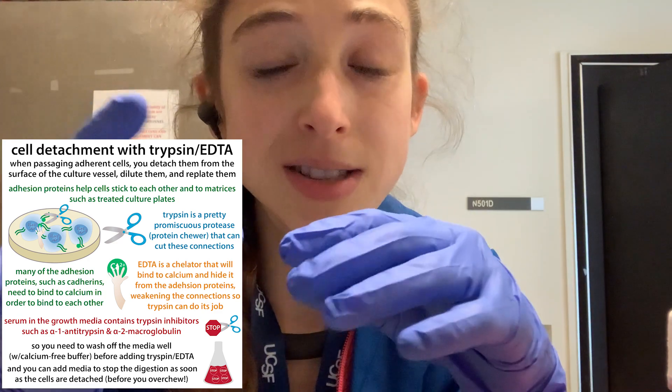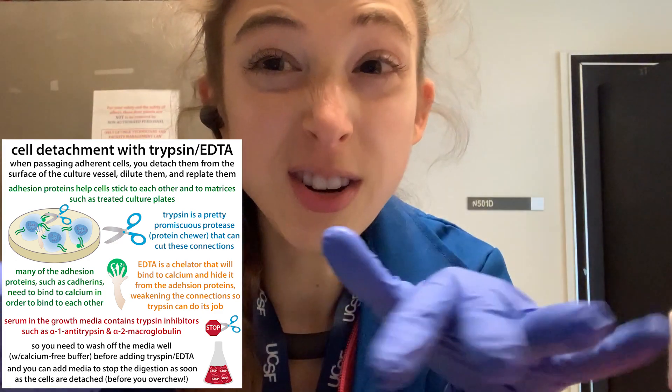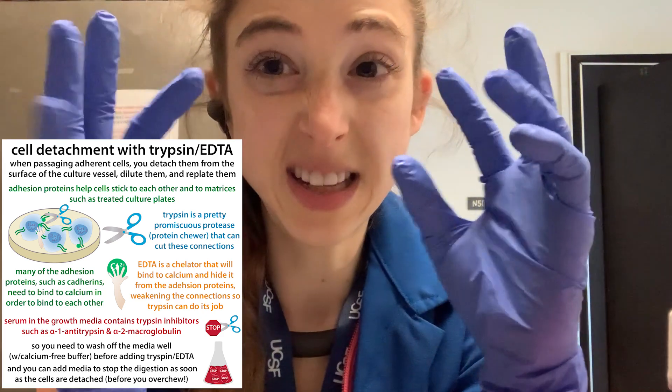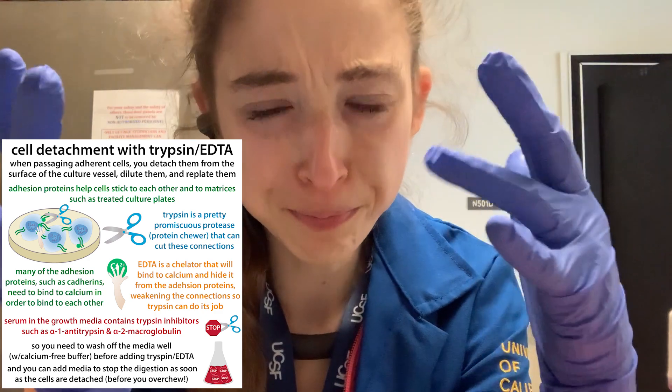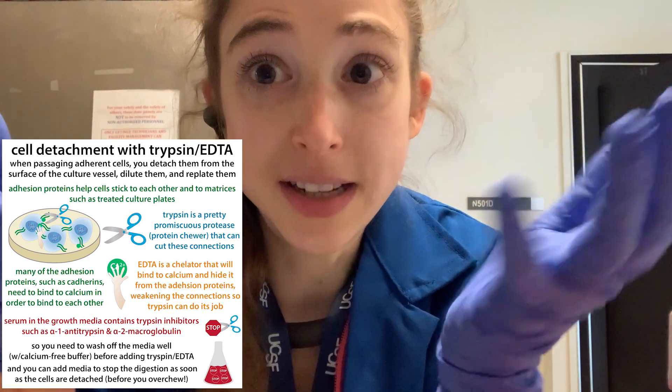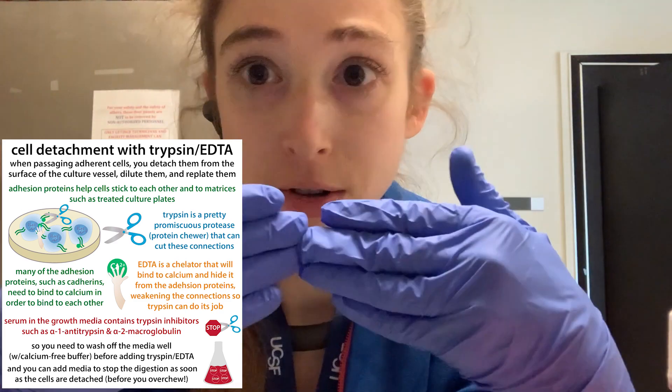Trypsin is good for digestion — in our bodies we make trypsin in our digestive system to help cut up food. We can use trypsin in the lab for various purposes. Here, one of our purposes is to cut up the protein-protein connections that are helping keep the cells adherent on the plate and connected to one another. These cells are stuck on the plate and stuck to one another with a variety of different proteins, like cell adhesion proteins.